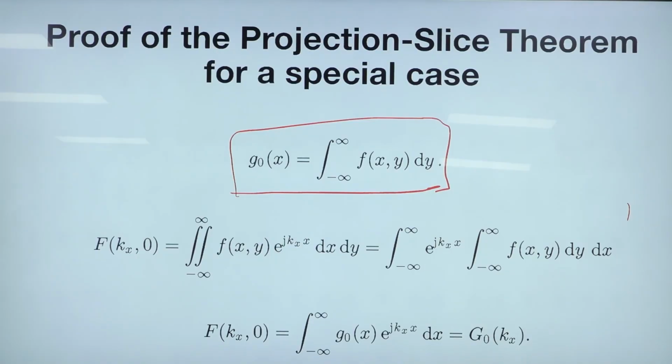So taking the data and compressing it along the y direction to get a function of x. You take the object and take the Fourier transform along the x-axis. So that is exactly this data over here. So taking the Fourier transform along the x-axis.